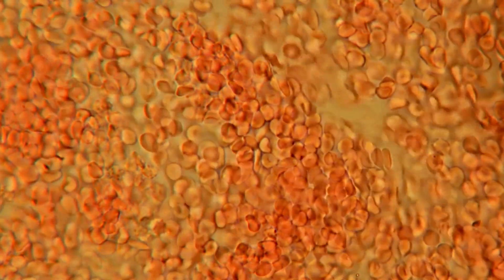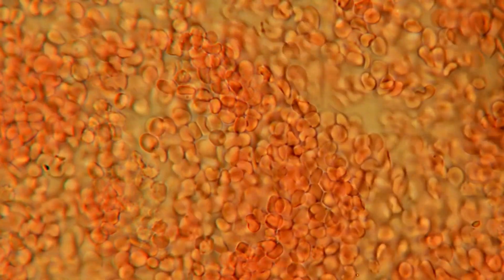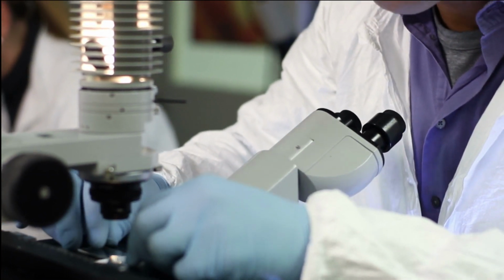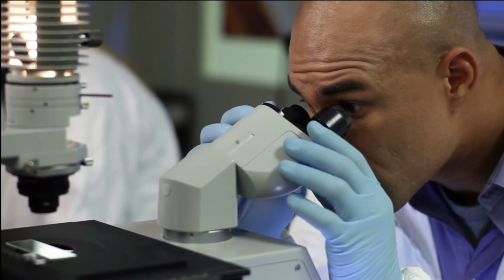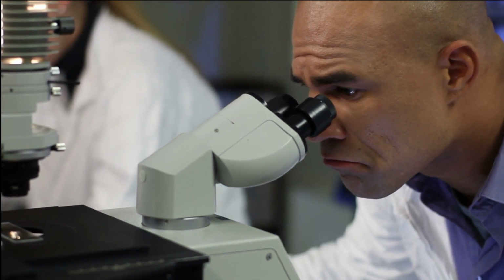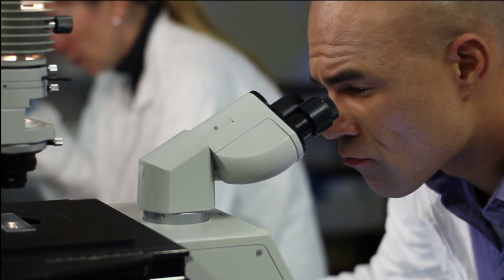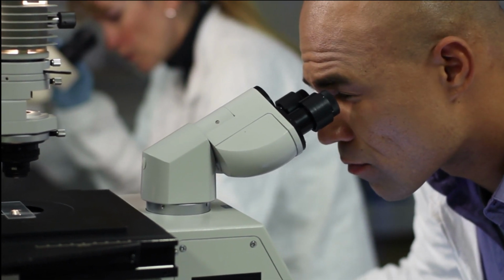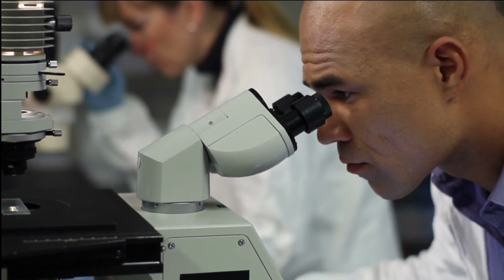There is a caveat here, though. Although a dipstick may indicate that RBCs may be present in the urine, there may be a reduced number of RBCs seen or no RBCs seen. This occurrence may be due to the RBCs lysing, or breaking apart. The cell wall of an RBC allows fluid to flow in and out of itself, but if too much fluid moves inside the red blood cell, then the cell wall ruptures, and this rupture is called lysing. The scientist will discern from the dipstick reading, the microscopic examination, and the preliminary diagnosis whether there are truly RBCs in the urine or if the RBCs have broken apart.